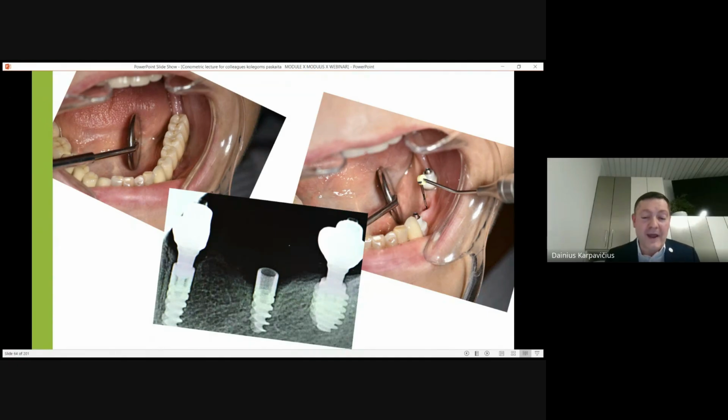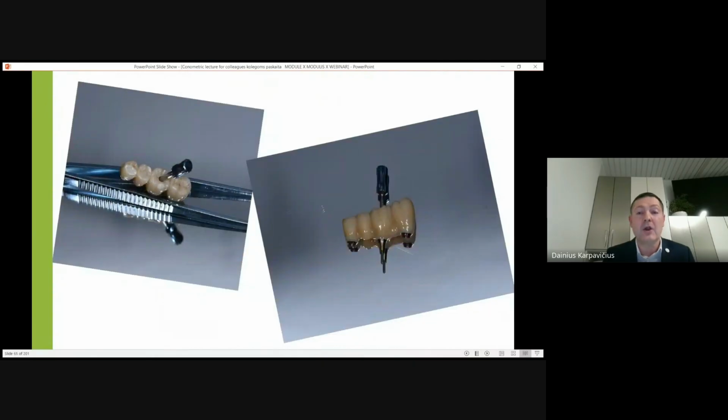And it's very funny, but we used the middle implant for reconnection of the bridge, and the comment from the patient was, doctor, it was so quick and so easy. And I knew that today I will have a webinar talking about this. It was funny for me because she gave me a comment about what we are talking about. Doctor, it is so easy. Yes, we used to take a look. We just used the middle implant, and later on take a look more carefully.